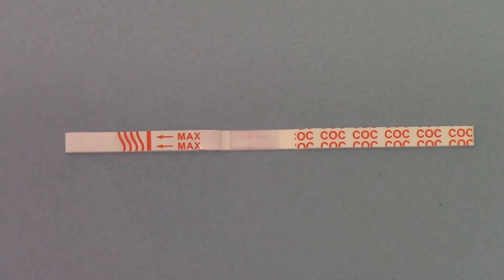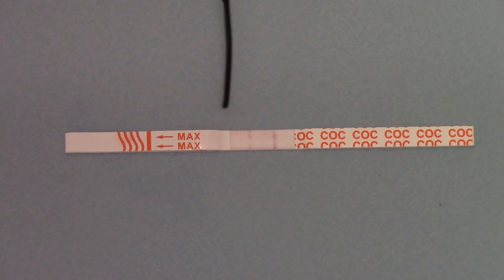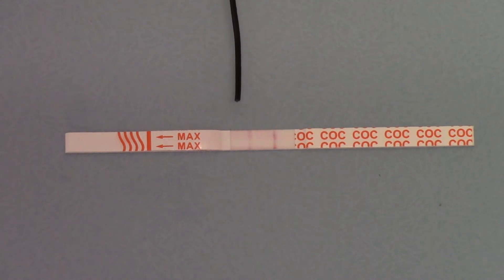Welcome back to this product demo for the UltraCocaine DCO101 urine test strip. This test strip has now been dipped into a negative control solution for approximately 5 to 10 seconds, and what you can see now running on the central portion of this test is the pinkish dye running between these two areas in the center of the test strip.